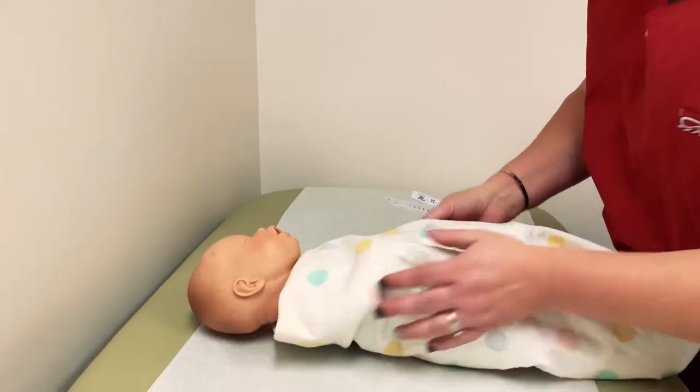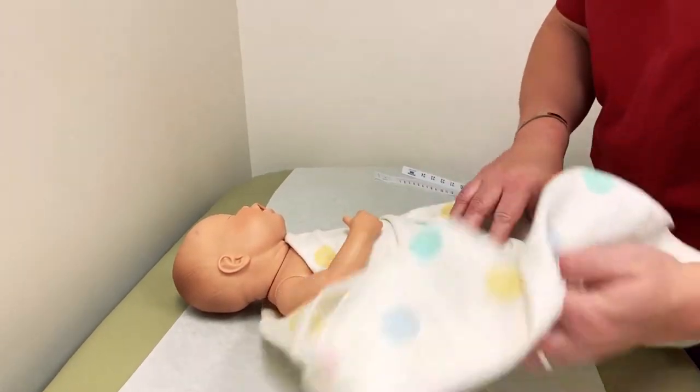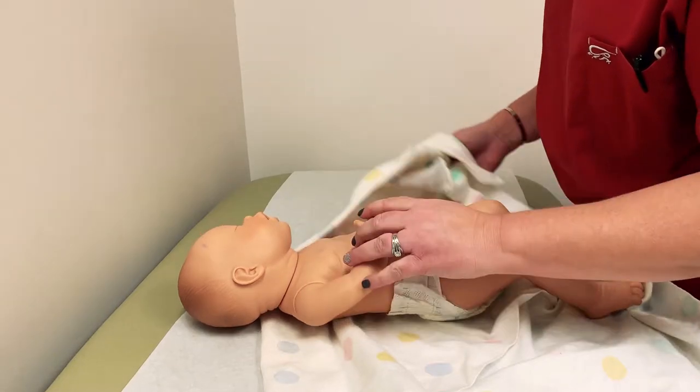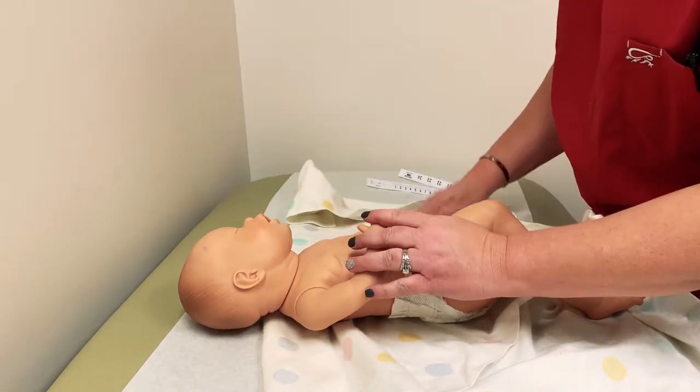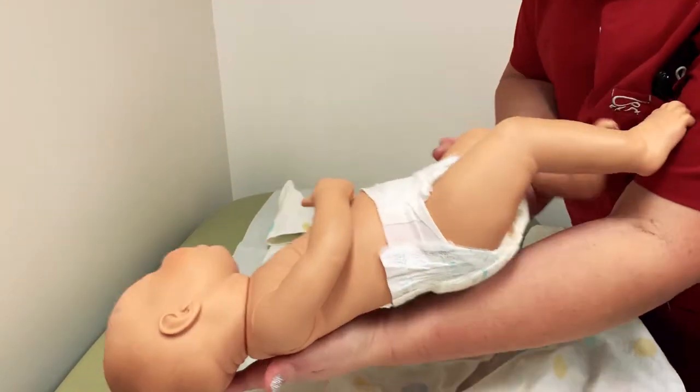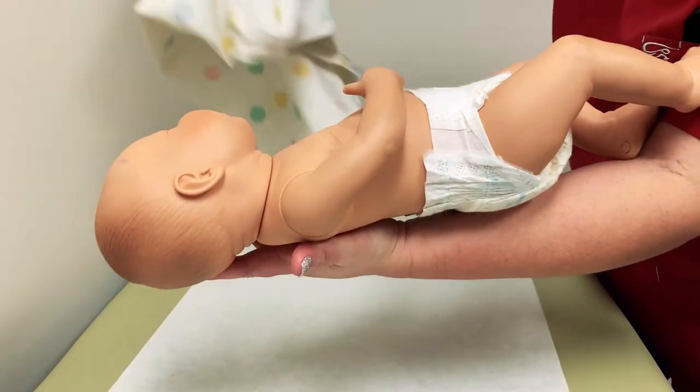First you want to make sure the baby is just in a diaper. For weighing purposes you want to make sure you take the baby down to the diaper, but before we weigh this guy, we are going to measure him.